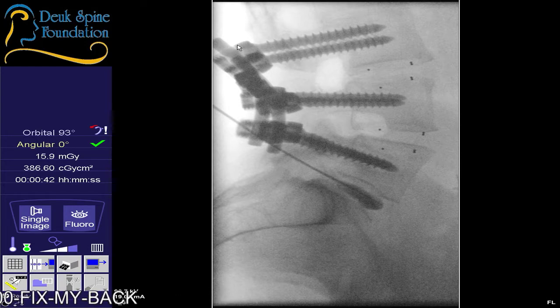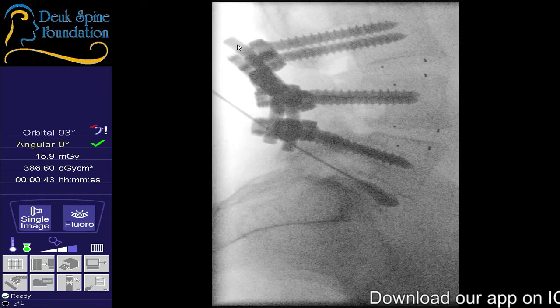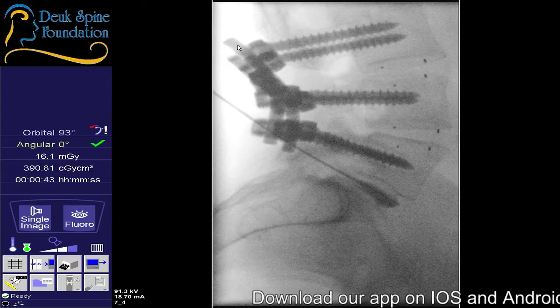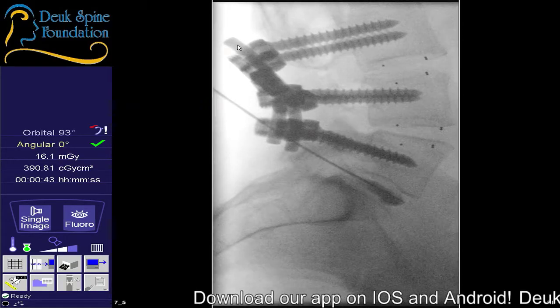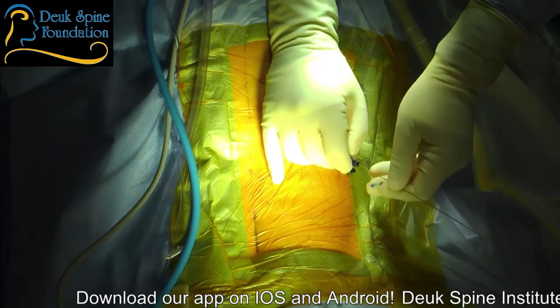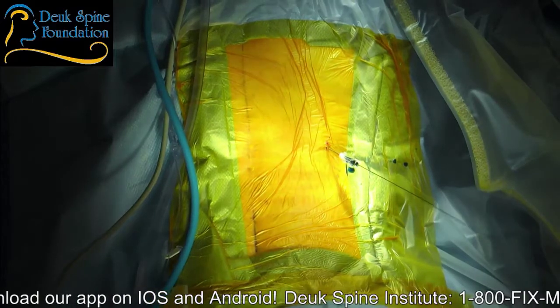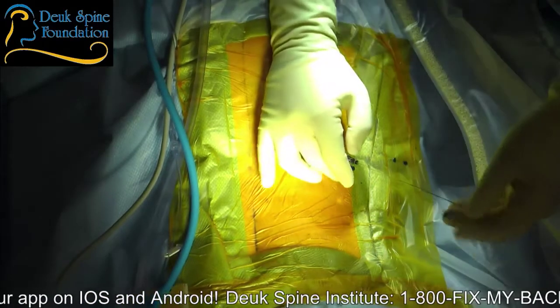So we got 10 out of 10 concordant at L5-S1. I want you to count from 1 to 100 out loud. Can you do that? She's asleep? Good. All right. Lateral. All right, I got to make sure the guide wire is out through the front. Shot. Shot. That looks like the guide wire there, right? You agree? Yeah, I agree.